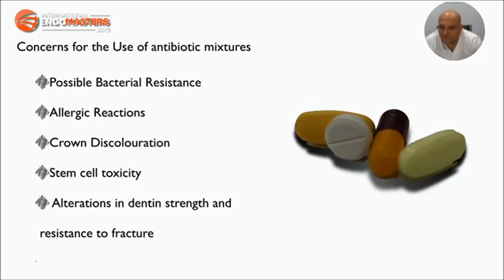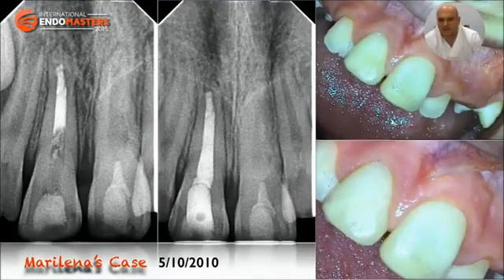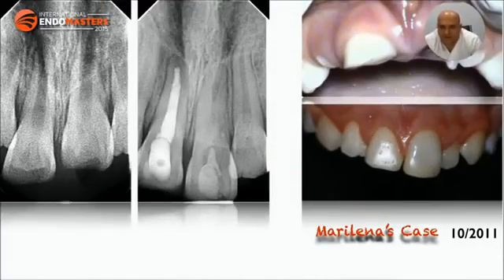Little Marlena missed all the scheduled appointments and returned 1 year later. 1 year later, the periapical radiograph revealed continuous root development and dentin wall thickening. Interestingly, the lateral wall defect seemed to be healed. However, no signs of pulp vitality were present. 2 years later, the clinical radiographical image reveals normal tooth development but still no signs of vitality.